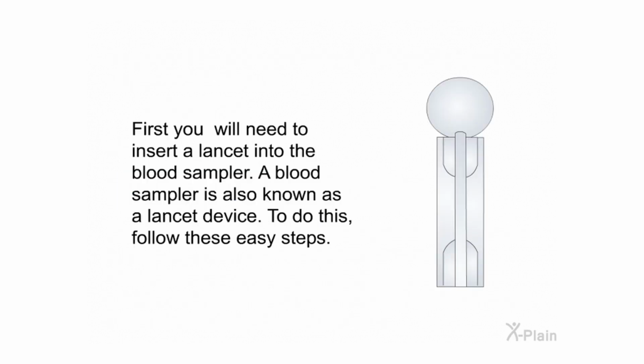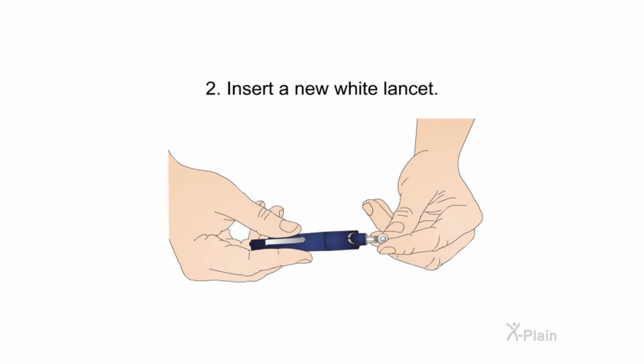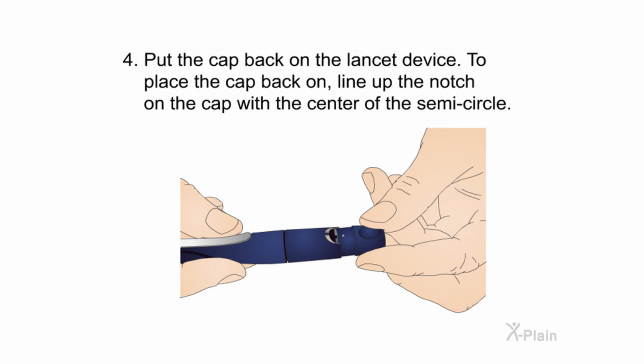First, you will need to insert a lancet into the blood sampler. A blood sampler is also known as a lancet device. To do this, follow these easy steps. 1. Pull the cap off the lancet device. 2. Insert a new white lancet. 3. Twist off the lancet's protective cap. 4. Put the cap back on the lancet device. To place the cap back on, line up the notch on the cap with the center of the semicircle.